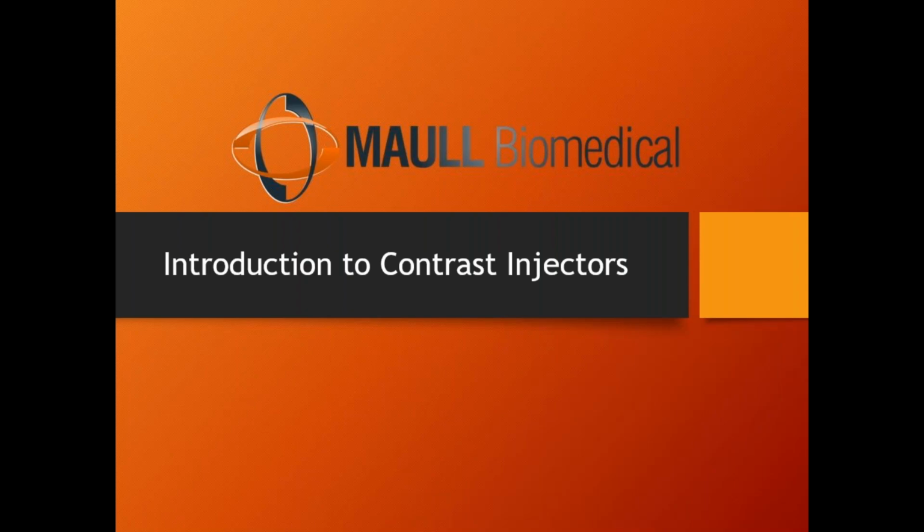There's really nothing to it. It's just a pump. It is a high-end pump. It's a piston pump, a high-end piston pump, but at the end of the day, it's just a pump. I don't care how much you dress it up. I don't care what piece of medical equipment you connect it to. It's a pump. So what we're going to talk about today is just the basic operation of pretty much all contrast injectors.